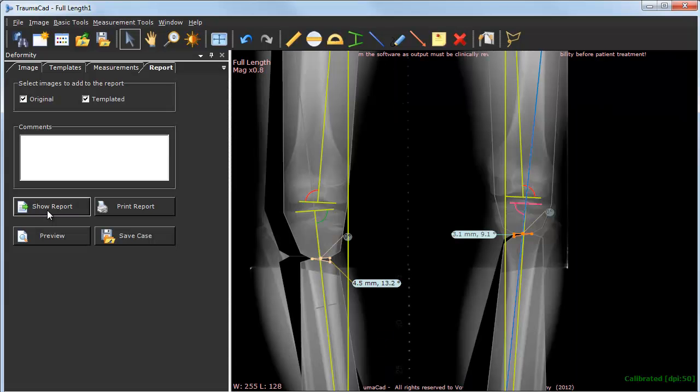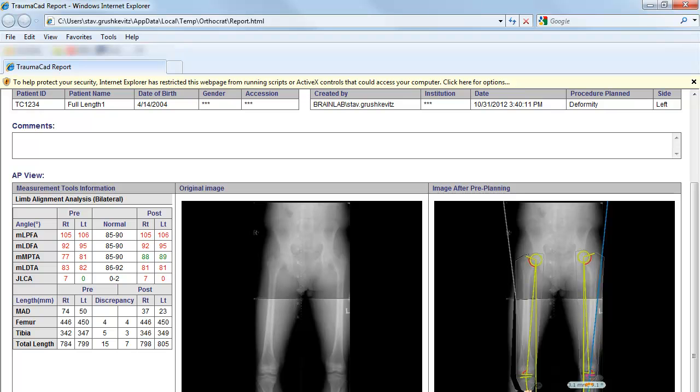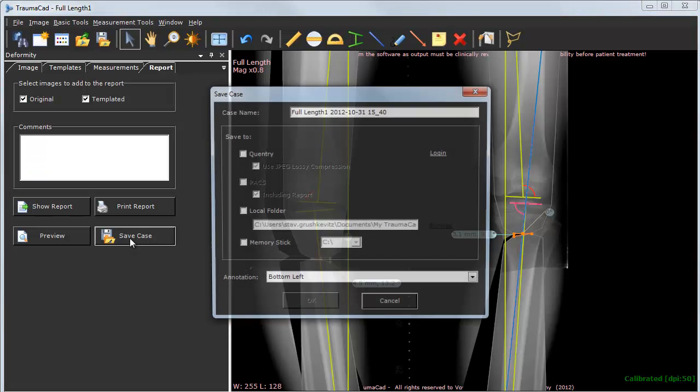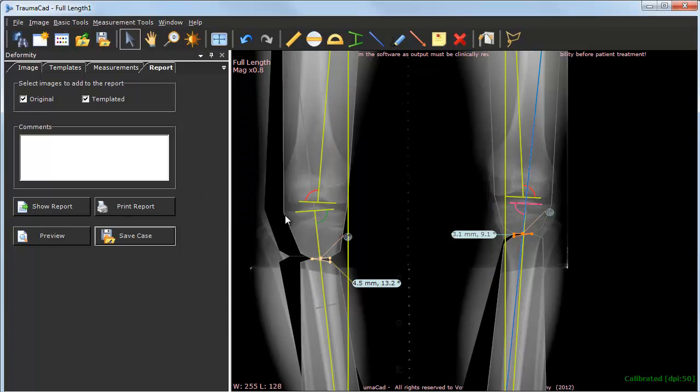The report includes the patient's information, selected implant information, and any measurements taken, as well as the original and planned images. Save the case to any desired location. Measurements and evaluations integrate into patient files for easy transition to digital radiology.